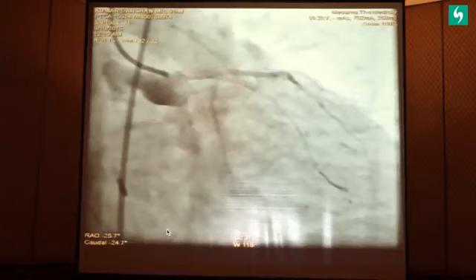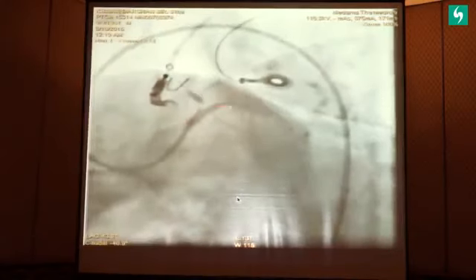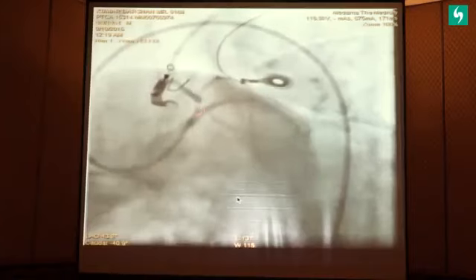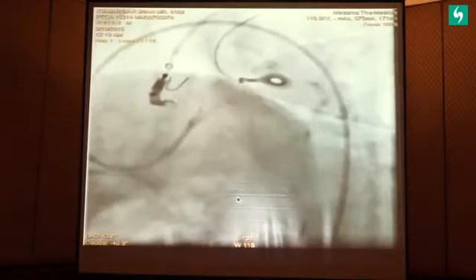So I had no choice. I had a patient who would die if I didn't do anything. So I put in a stent from here into the ramus rather than putting in the LAD. I left the LAD blocked like that because I wanted to save him there on the table. So I put the stent in the circumflex through this, and you can see this is a tight stenosis in the ostium of the LAD, and the wire was finding it difficult to go.